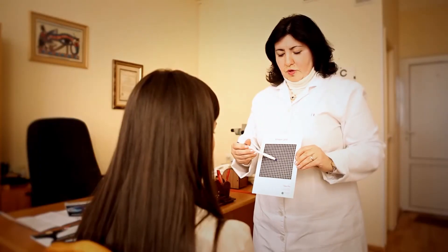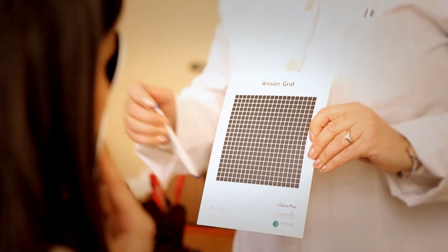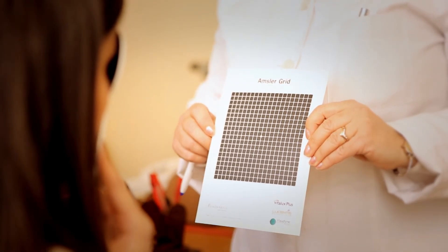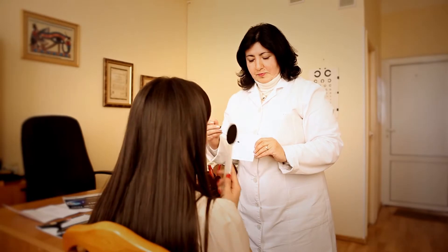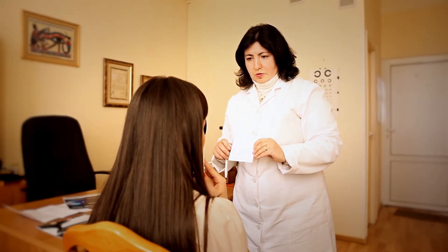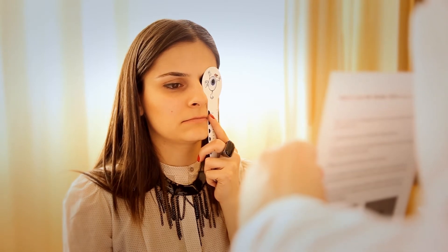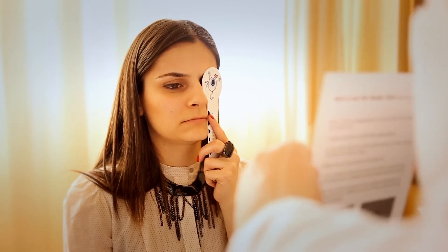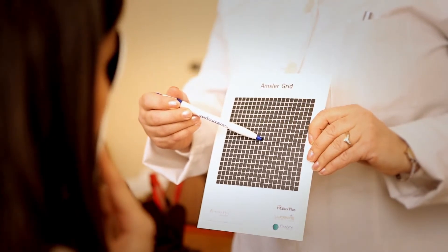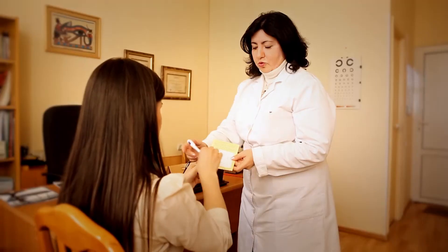The Amsler grid test is intended to reveal any abnormalities in the central area of the visual fields. Have the patient hold a white on black test card about 16 inches away from one hand and cover one eye with the other hand and an occluder or a patch. Direct the patient to stare at the center dot and to report if any portions of the grid are blurred, distorted, or absent.